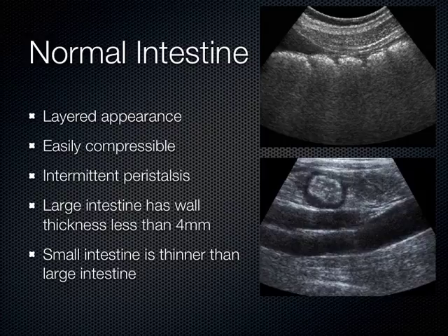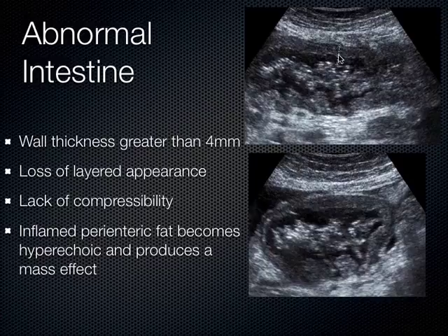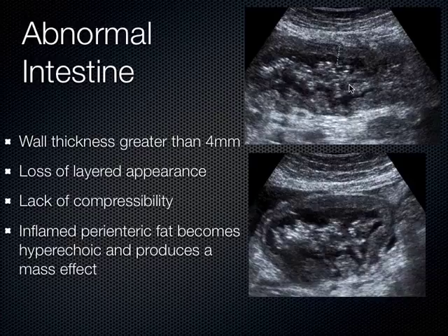Large intestine has wall thickness up to 4 millimeters. Small intestine is less than that — somewhere between 3 and 4 millimeters. If you ever have wall thickness greater than 4 millimeters, no matter what you're looking at, that's an abnormal disease state, whether it's colitis or something else. You just measure the wall from the outer rim down to where the lumen begins, where the air starts. In normal individuals, less than 4 millimeters is the norm.